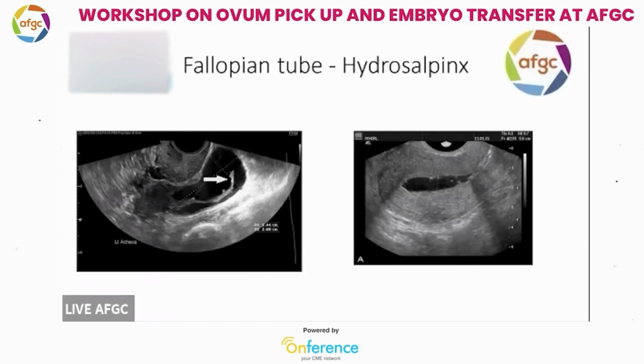So, to assess a patient, it is never a single scan. You have to do it at least twice over a period of time to confirm your diagnosis. The next thing is about the follicle and the cyst. Usually the cysts will stay from the beginning of the menstrual cycle and stay constant throughout.